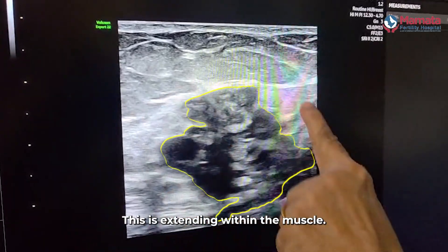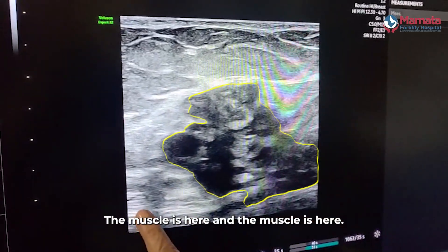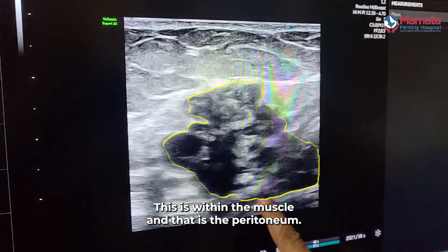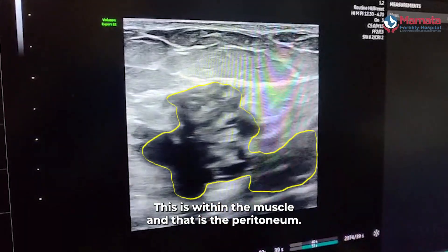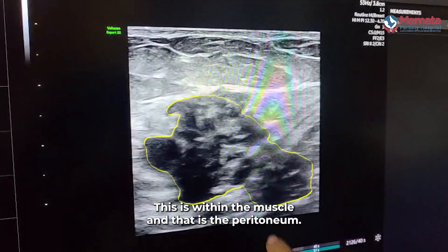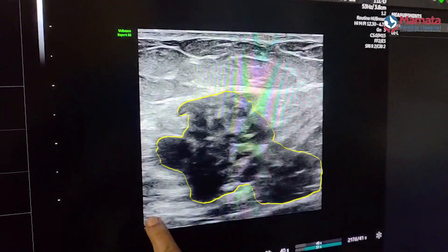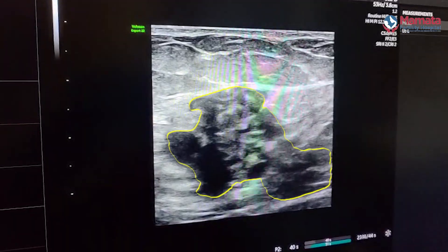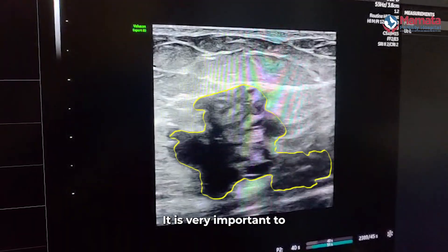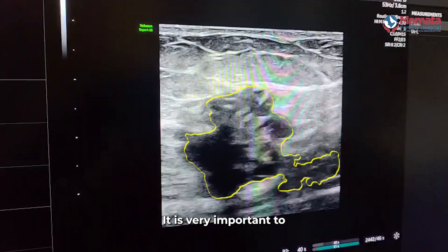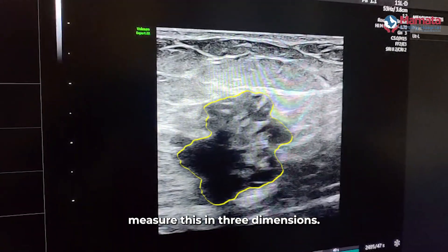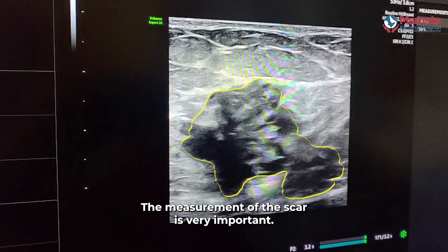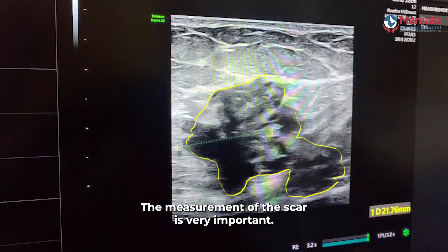This is extending within the muscle — the muscle is here and here. This is within the muscle, that is the peritoneum, and this is above the peritoneum. It is very important to measure this in three dimensions; the measurement of the scar endometriosis is very important.